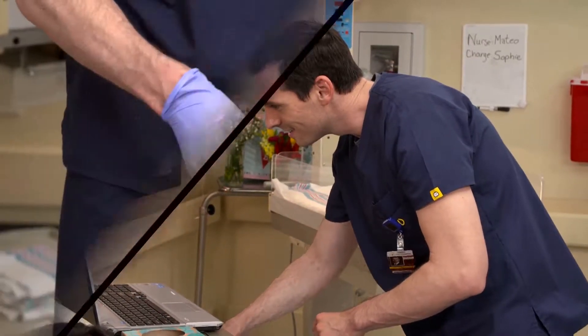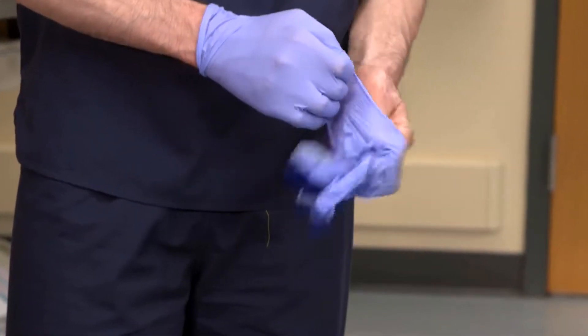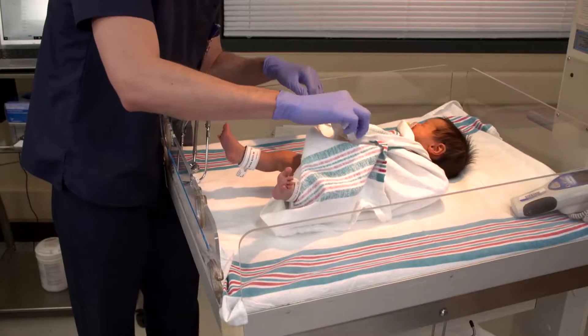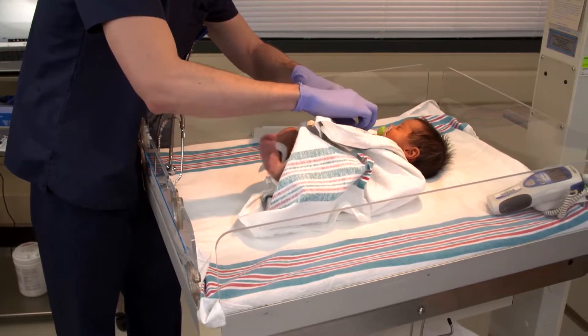That all matches. Before obtaining the newborn's vital signs, sanitize your hands and put on gloves. It's important to observe the infant's color and respiratory effort before disrupting the baby.